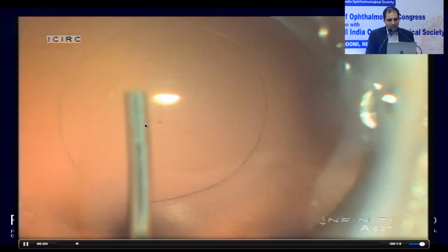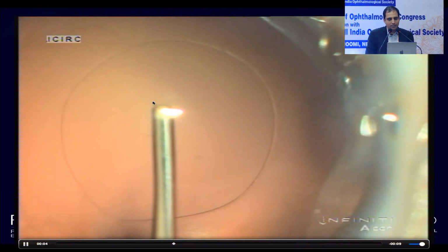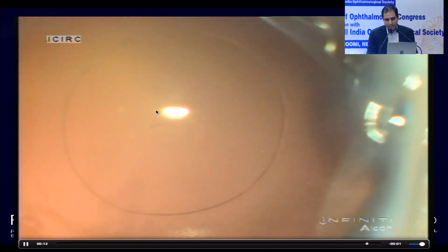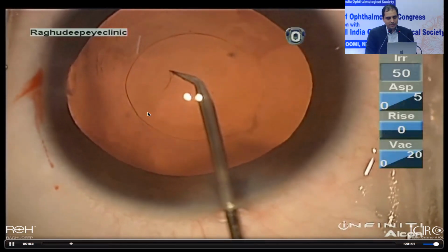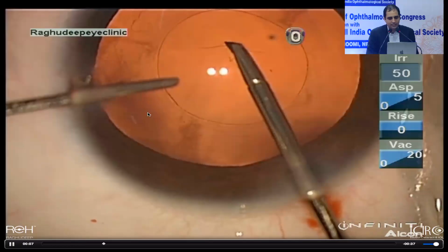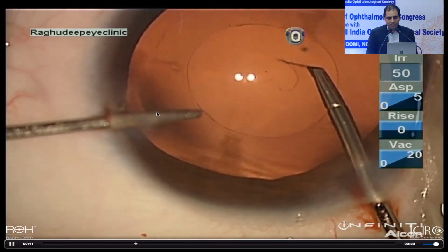So this is what I mean. This is the puncture, and we are injecting all around, surrounding the posterior capsular puncture, so that the part becomes concave, and when you try to grab it, you don't end up with a very forwardly bulged posterior capsule. So this is to show we have created the puncture by lifting it up, and once that is done, I think here the role of micro incision capsulorhexis forceps is of paramount importance.